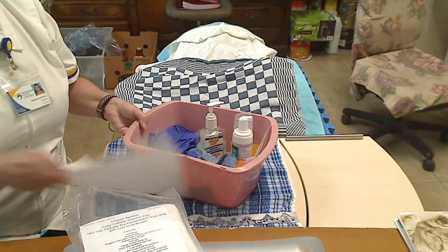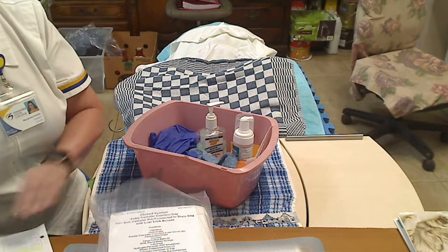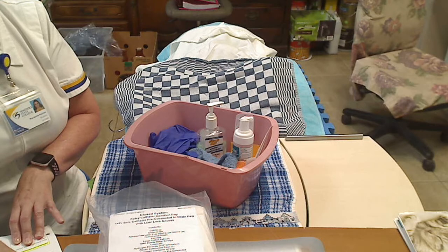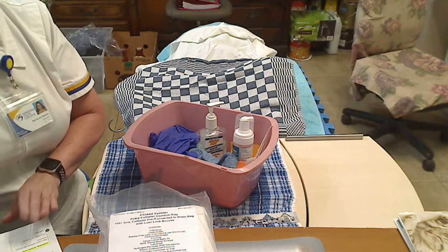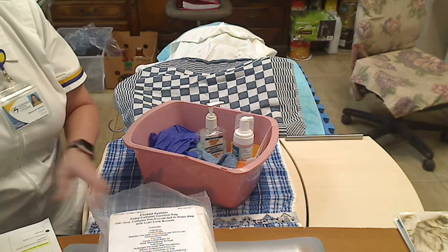My first set of rights that I'm going to do is within the med room. I am going to confirm in EHR that Anna Povolowski, date of birth 5/5/1957, with an allergy to penicillin and a reaction of hives, is in fact due for an indwelling catheter insertion. And today is 7/6, and it is currently 13:36, and that's what time it needs to be done.